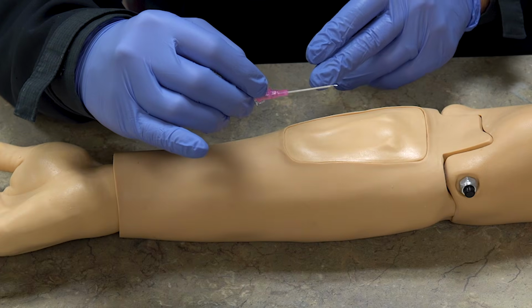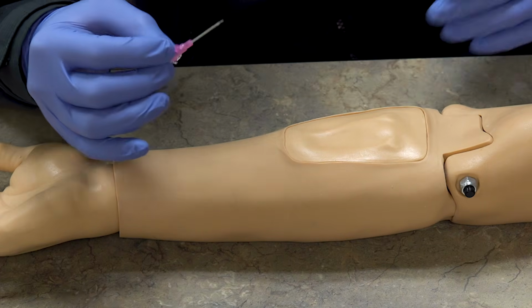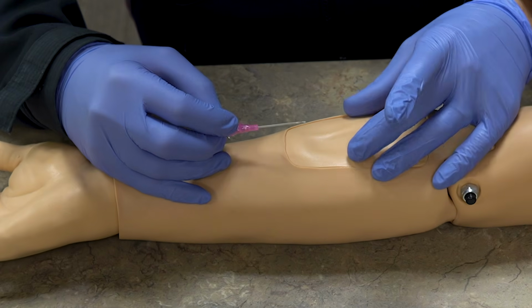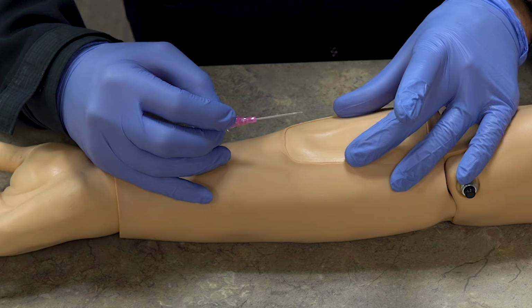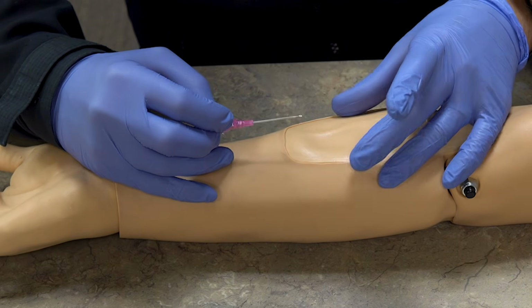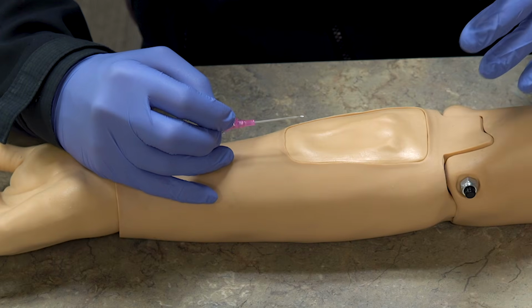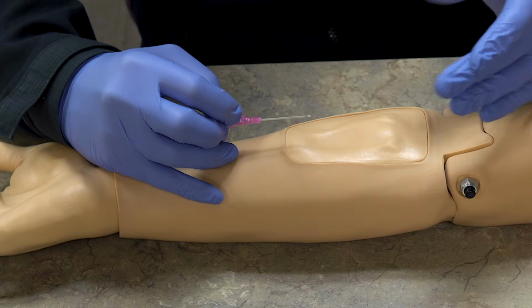So we've sterilized the site, we've selected it, everything's good there. I'm gonna take this hand, or whatever's free, and I'm gonna try to hold the skin down. You can pull traction down this way, you can pull it down to the side, just make sure you're not gonna stab yourself. And what that's doing is actually taking the vein and flattening it a little bit more and stabilizing it, so when you try to poke, the vein doesn't roll out of the way.